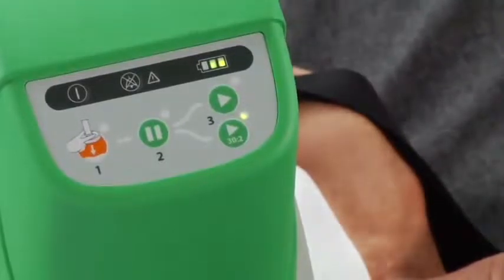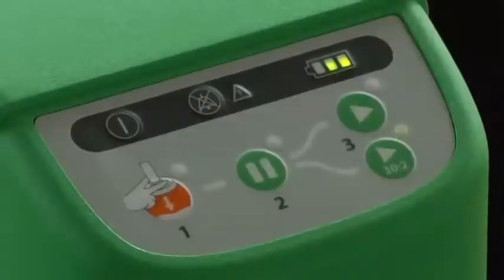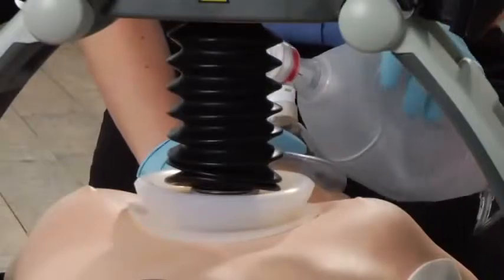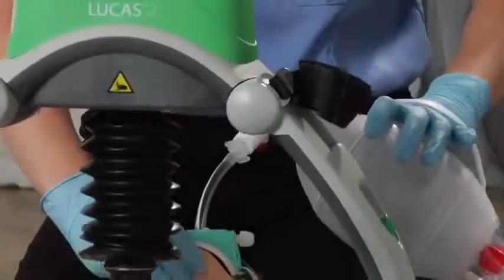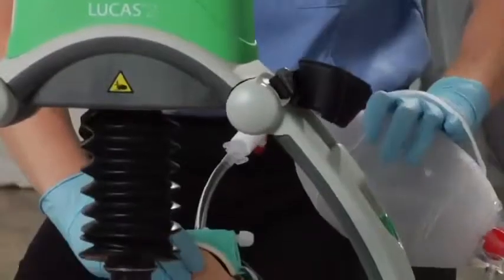If you are ventilating with a bag mask, use the active 30 to 2 button. After 30 compressions, Lucas pauses for 3 seconds to let you deliver 2 breaths, then resumes compressions for 30 more. Once you have an advanced airway like an endotracheal tube in place, you can switch to active continuous mode and deliver ventilations without pausing compressions.